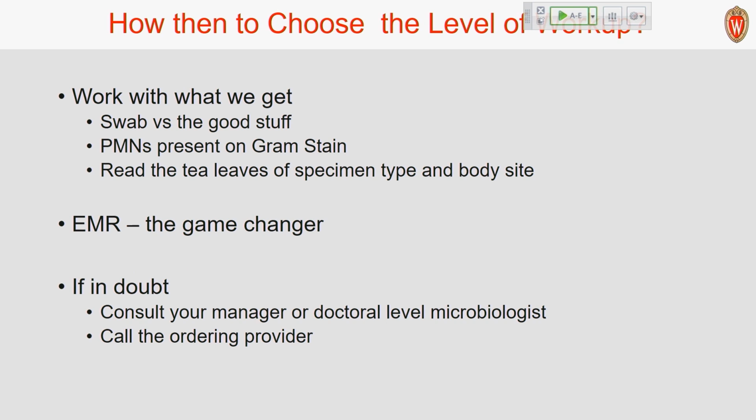We're going to get swabs, but as we've talked about earlier, are there PMNs? We round every day in our laboratory, maybe me or the other doctoral scientist and microbiologist, and that's the number one question. Dr. Novicki, should I work this up or not? There's only a few of them, and it's only on one plate, and what does the Gram stain show? And I think, as I just mentioned, I broached the subject of the EMR.